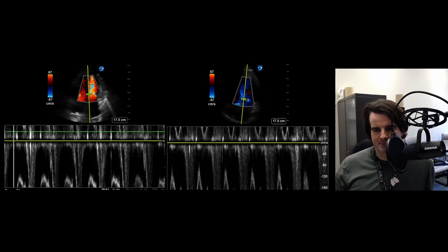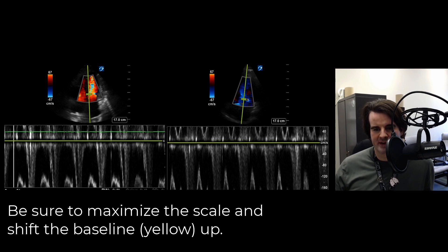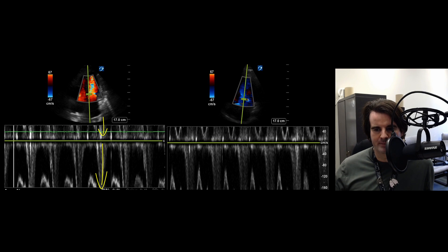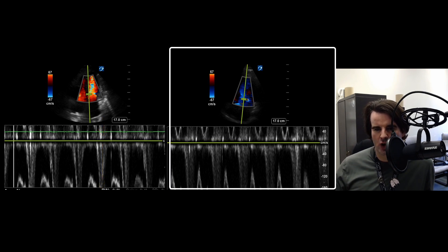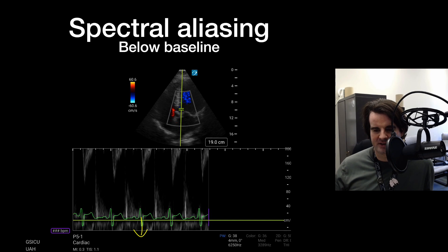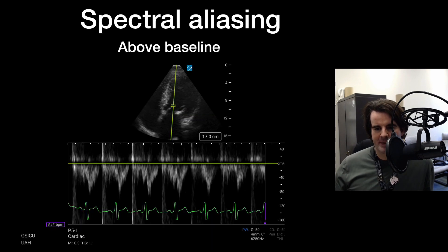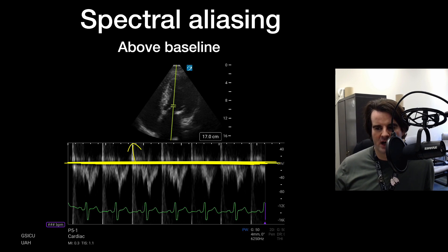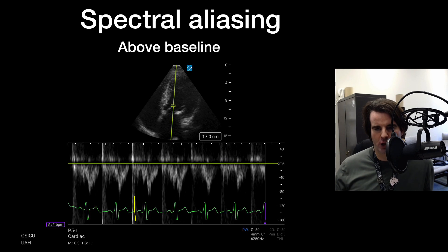Here we can see that the velocity of blood trying to escape the left ventricle through the outflow tract is too fast for pulse wave Doppler, causing aliasing on spectral Doppler — the waveform goes from baseline down and repeats above the frame. On the right, there's still aliasing as you go toward the aortic valve itself. As an example of spectral aliasing: when the baseline is positioned low and flow is very fast, the aliasing produces the waveform on the upper part of the screen. Conversely, when aliasing occurs above the baseline and the full waveform can't be captured above, it's produced below the baseline.